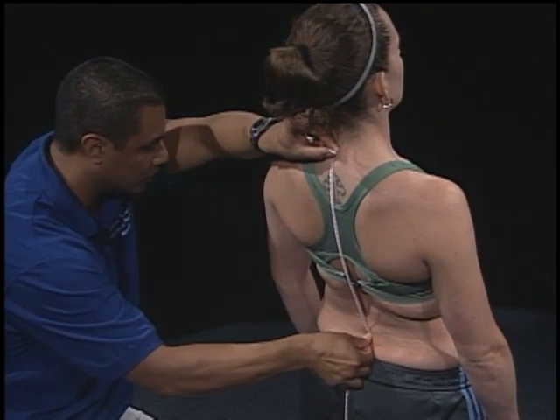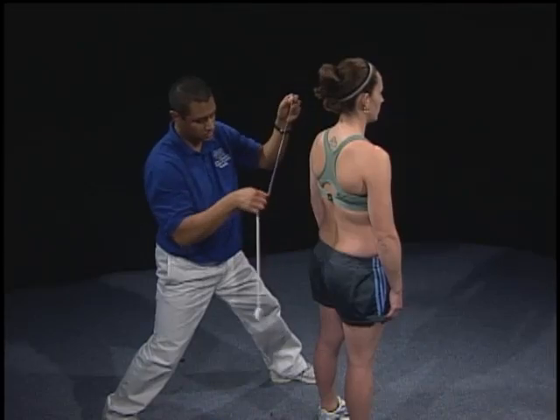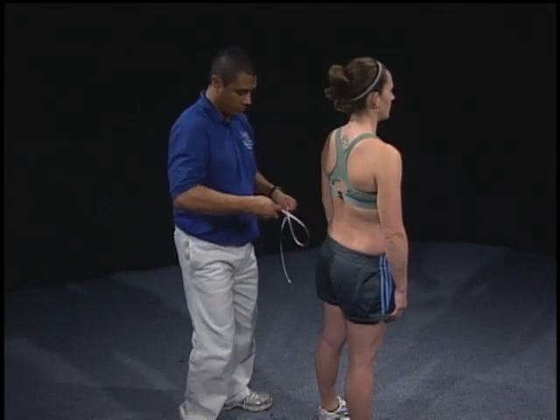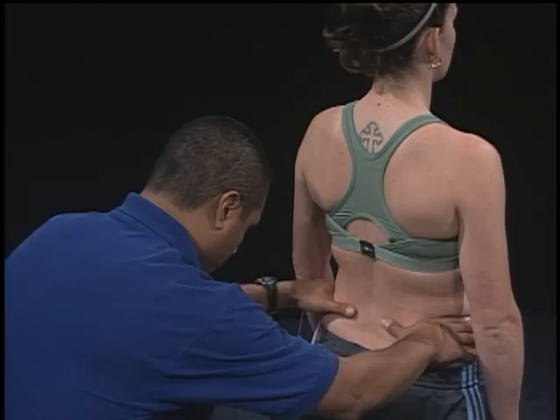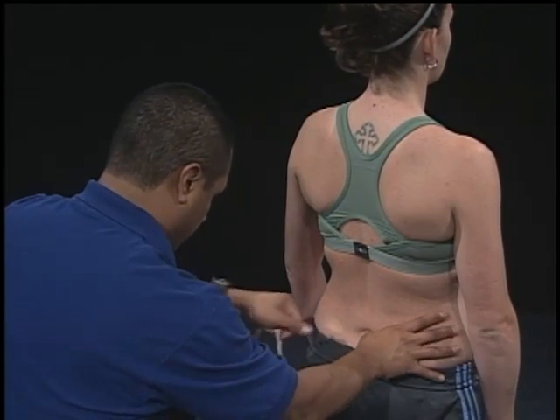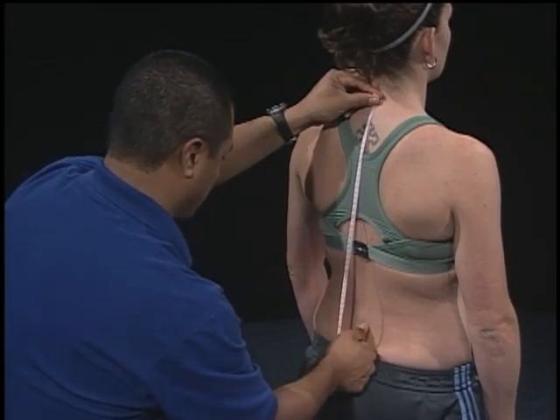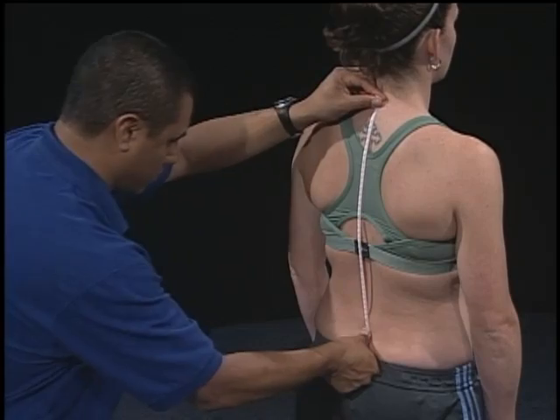The difference between the first and second measurements indicates the amount of thoracic and lumbar extension. Make a note of the difference measured. Measure twice. If the measurements are off by greater than 2 centimeters, take a third measurement. Take the average of the measurements and document it in the patient's chart.